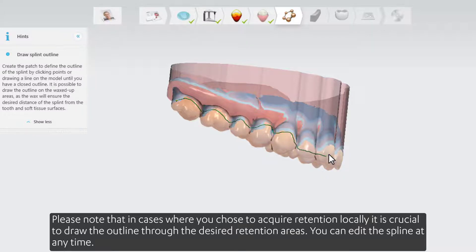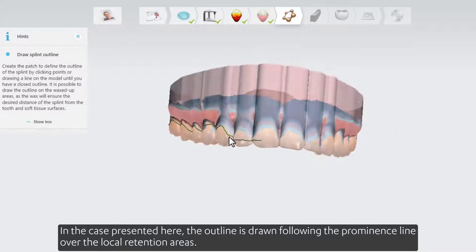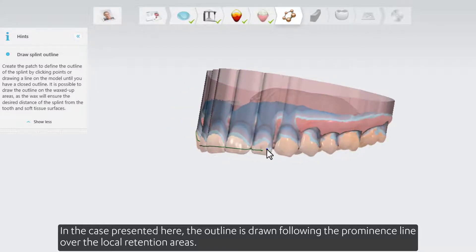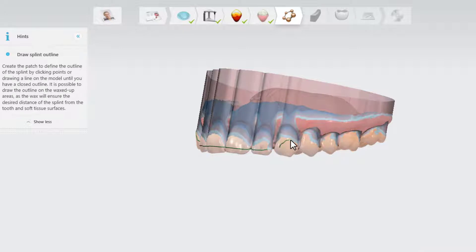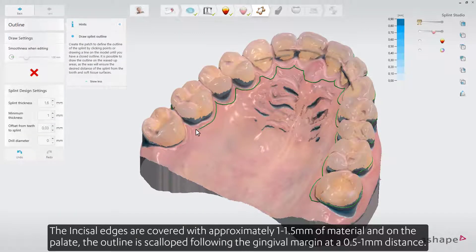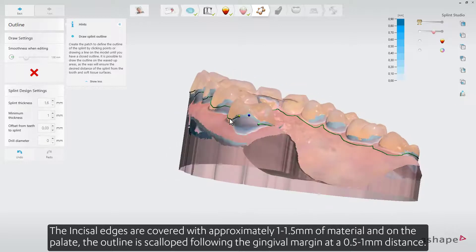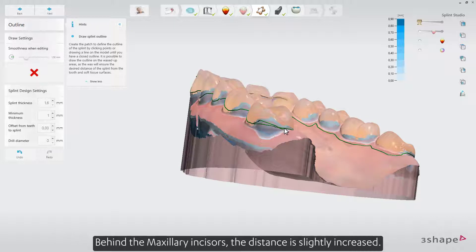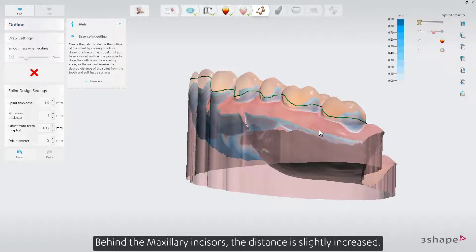You can edit the splint at any time. In the case presented here, the outline is drawn following the prominence line over the local retention areas. The incisal edges are covered with approximately 1 to 1.5 millimeters of material. And on the palate, the outline is scalloped following the gingival margin at a 0.5 to 1 millimeter distance. Behind the maxillary incisors, the distance is slightly increased.